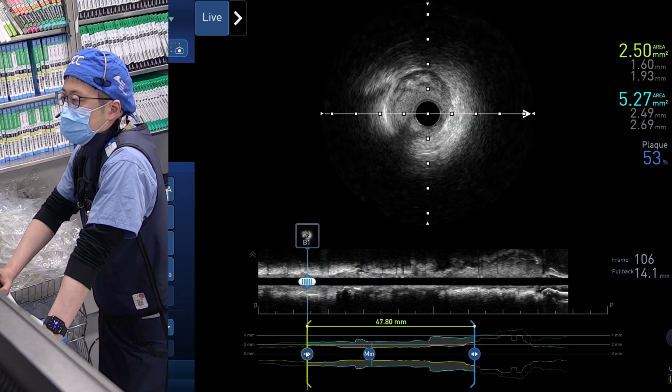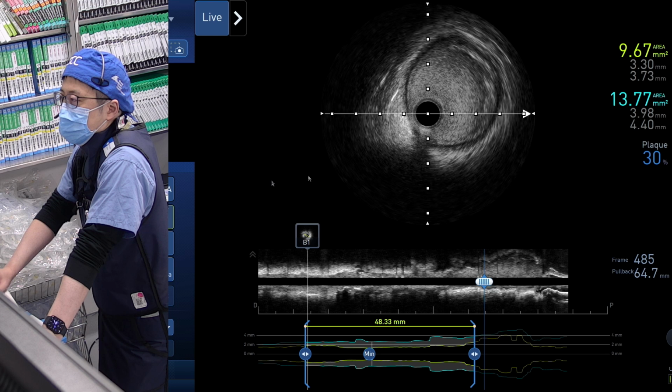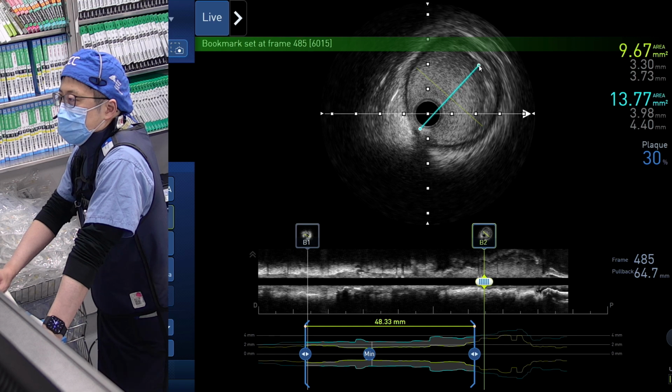No, see, there was a view there. You can't make it out. No, I was definitely there, a few areas of 280-degree calcification. Okay, get us this 2.5 by 48.